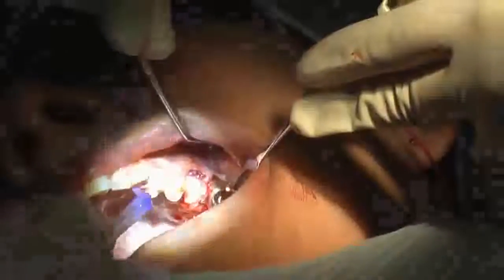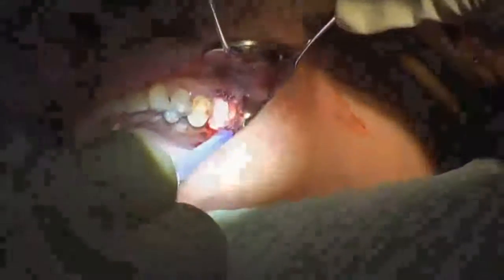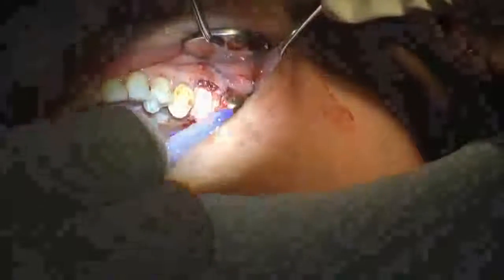Here we have a pipette of a product called Periacryl — a cyanoacrylate designed for dental procedures. You drip it on to the margin between the gingival margin and the socket seal. I like the violet color so I can see where the Periacryl has been applied. They also make clear Periacryl. These are single-use pipettes, and there's plenty in one pipette to complete your procedure.